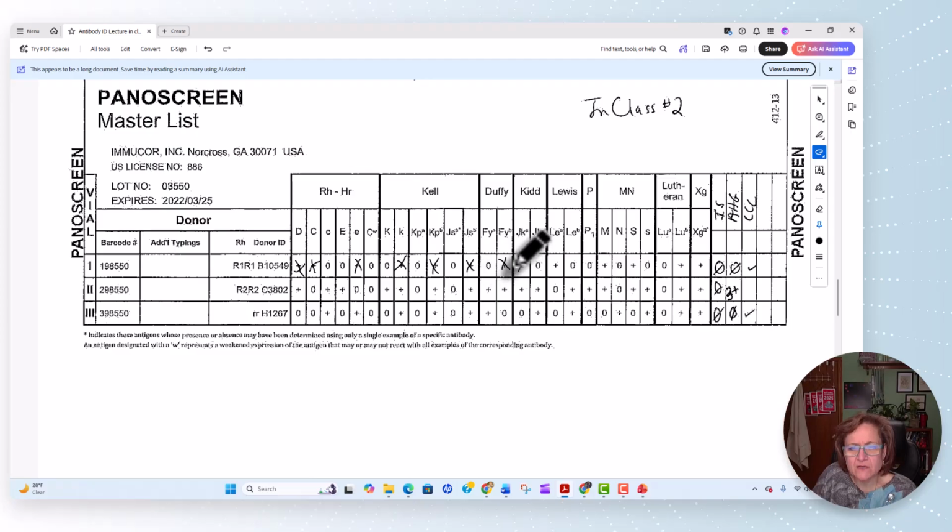So these are all single, homozygous cells where only one of them has it, the other one does not. So that's nice. That gives us X's versus just slashes as we're going through it all.